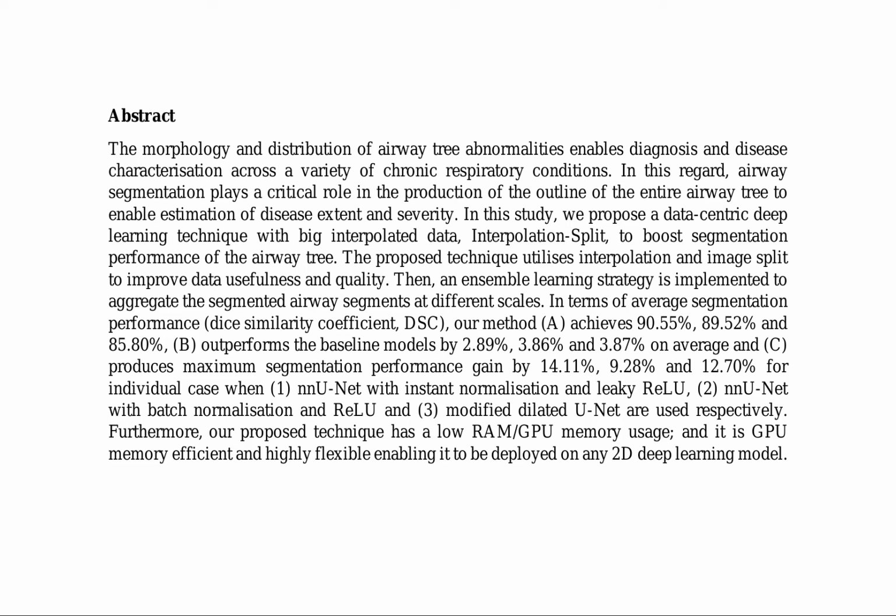The interpolation-split technique involves aggregating segmented airway segments at different scales using an ensemble learning strategy, which combines the strengths of multiple models to produce more accurate results. The proposed method demonstrates superior segmentation performance, achieving average dice similarity coefficients, DSC, of 90.55%, 89.52%, and 85.80%.